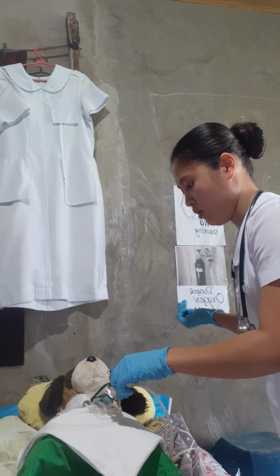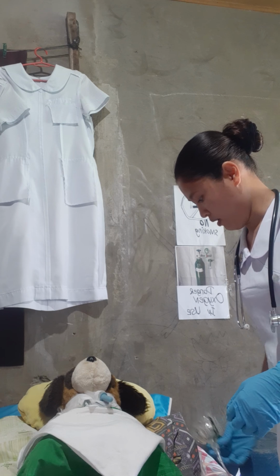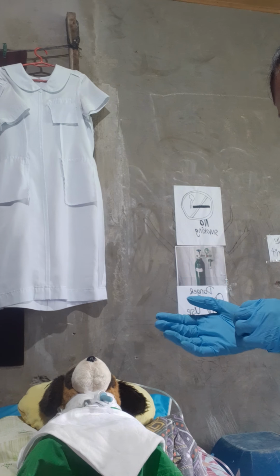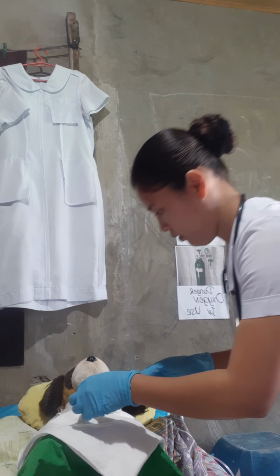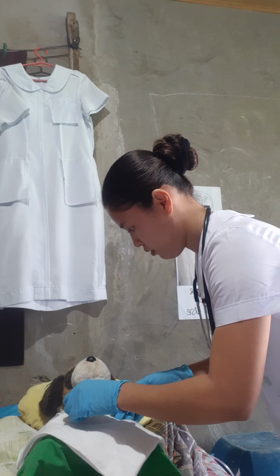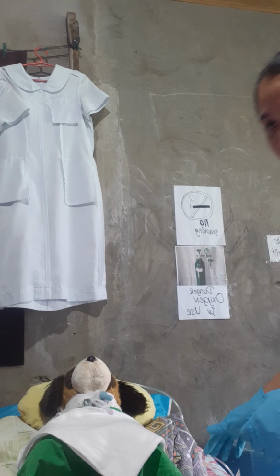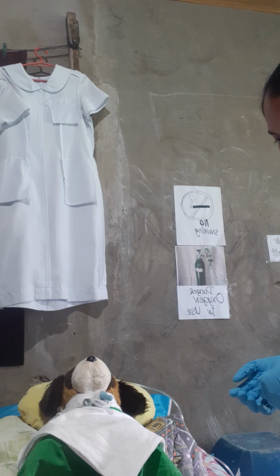Afterwards, we need to remove the oxygen device and remove the dressing also. Then stabilize the outer cannula and face plate.